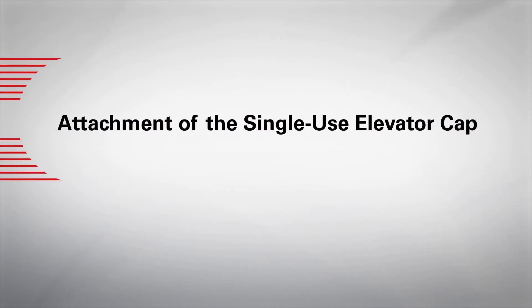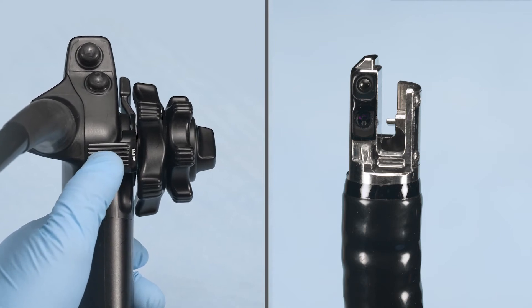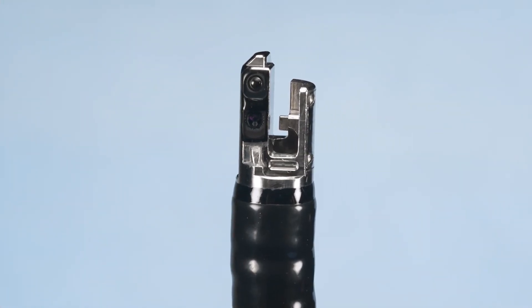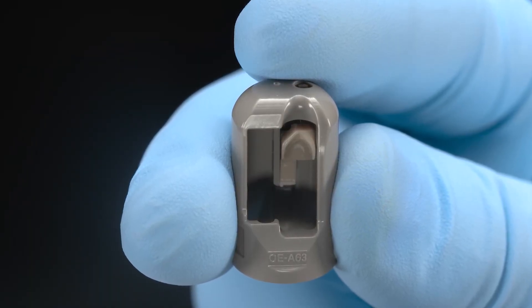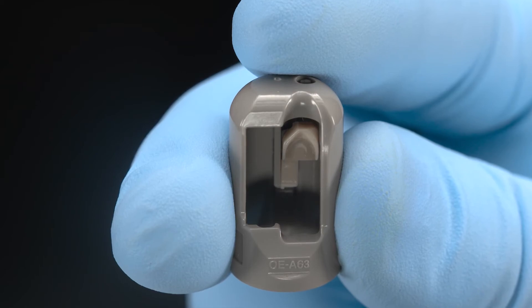Complete the following steps to properly attach the single-use elevator cap to the DEC-HD duodenoscope. Ensure the elevator link is in the disengaged or lowered position — move the elevator control lever proximally until it stops. Also ensure the elevator mechanism of the OE-A63 elevator cap is in the disengaged or lowered position.